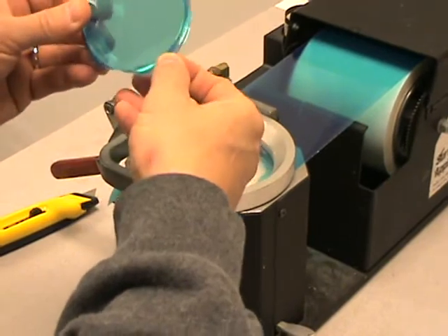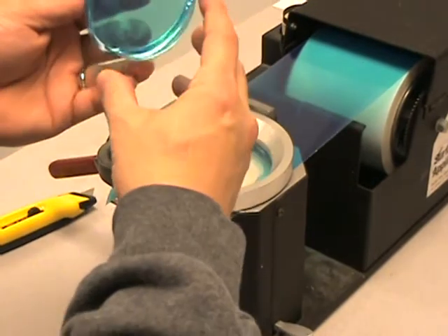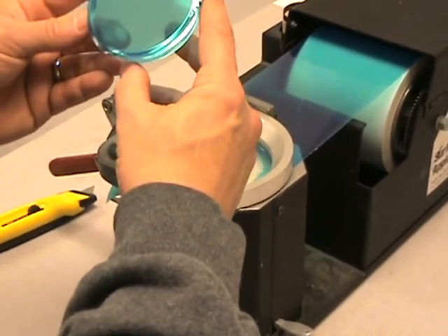On a higher base curve lens you may need to push down on some bubbles around the edge, again avoiding the center of the tape where the alloy wafer makes contact with the surface.